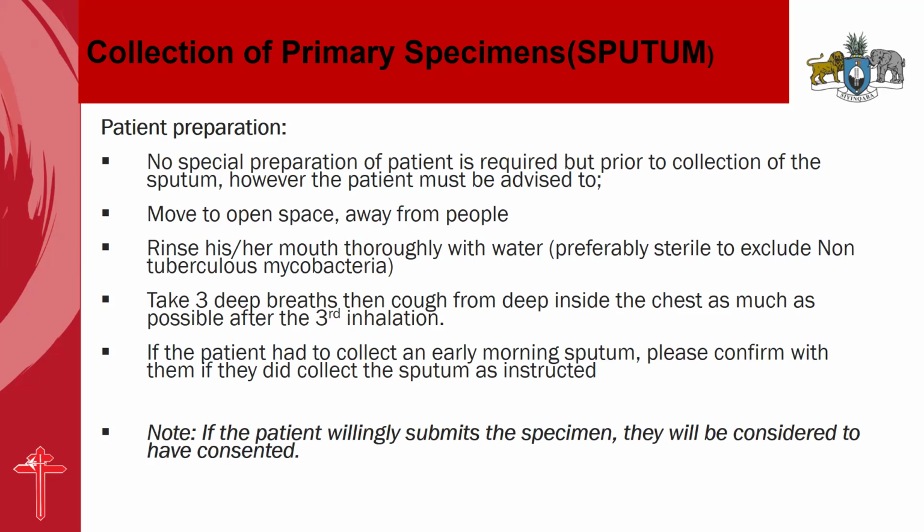and then advise the patient to take 3 deep breaths, then cough from deep inside the chest as much as possible after the 3rd inhalation. So 3 deep breaths, then cough after the 3rd inhalation. We are doing this to ensure that you get a good quality specimen instead of a salivary specimen, which is not going to give us good results.